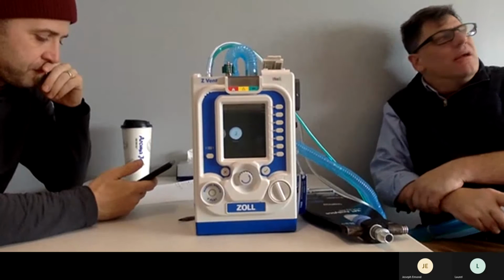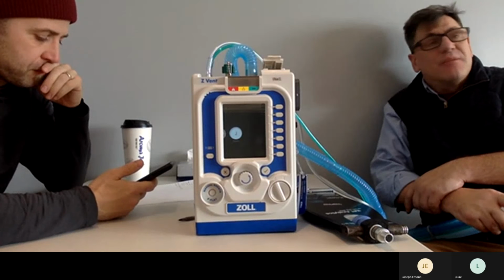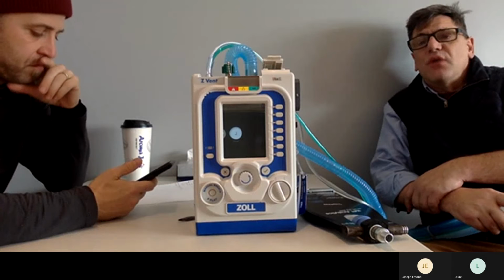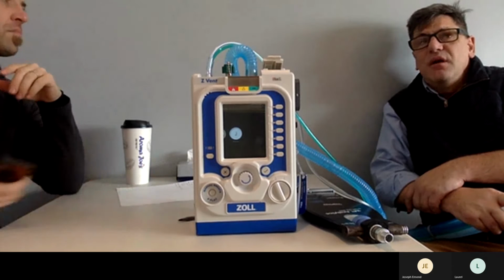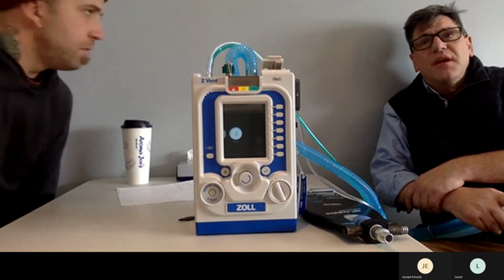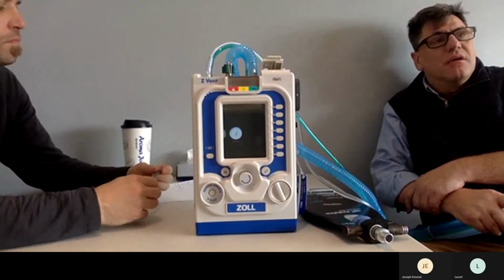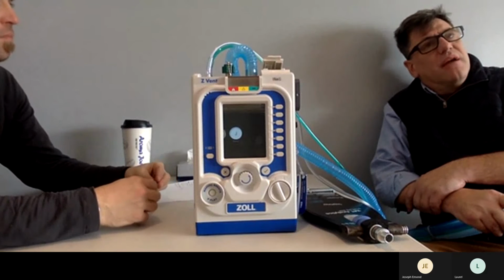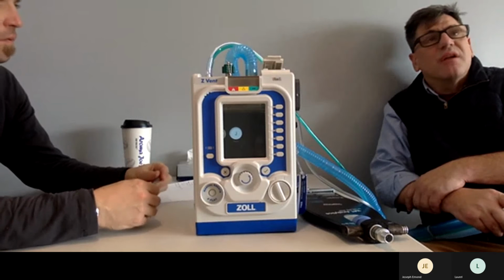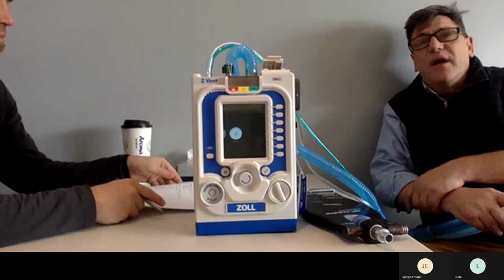In my opinion, if the work of breathing is there, they have enough energy, they have enough base metabolic rate, their ATP is there, their sugar's there, they do really, really well on CPAP. When they get tired, they need the work of breathing assistance, and you should be on BiPAP. If they're not so tired yet, don't jump, right? Just like all patients don't get oxygen with a non-rebreather. Sometimes we start with a cannula if they don't need more, right? But be ready to jump.